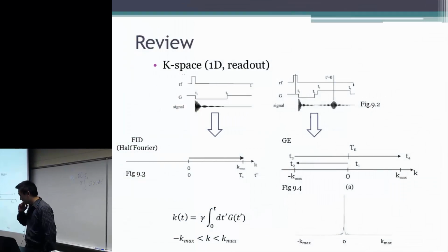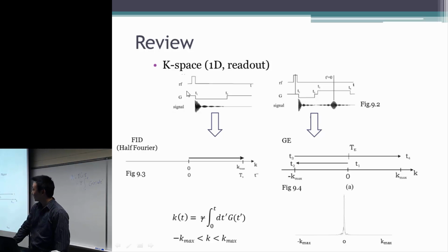All right, so we have the same thing here. If we just directly collect the FID signal by applying a readout gradient, actually we are only collecting half of the so-called echo. This is what we call a half-echo acquisition, where we directly start collecting data from the center of the K-space until the edge of the K-space.